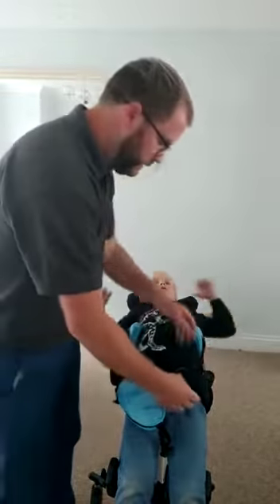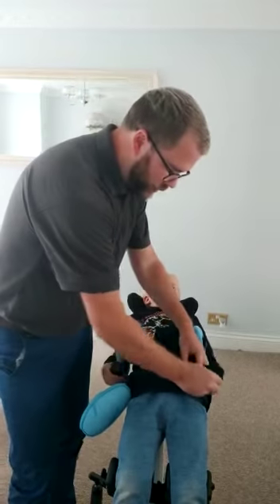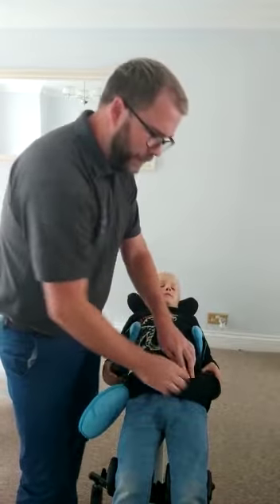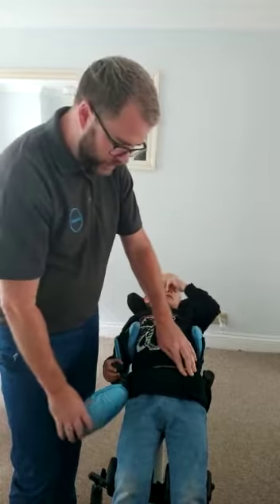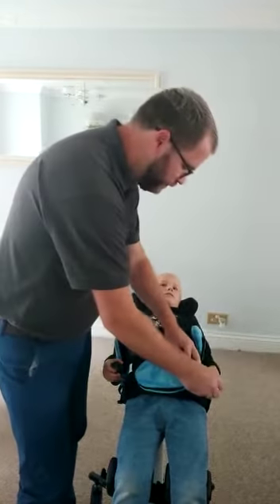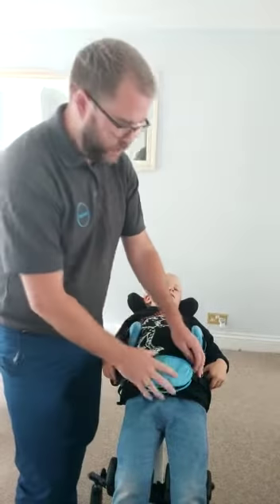Lay down, just stay there. You just need to put the black one across first, and what happens is you have to actually just bring that back onto itself and fold it like so, and then the blue one — and not forgetting everything has to be really quite tight on the support.